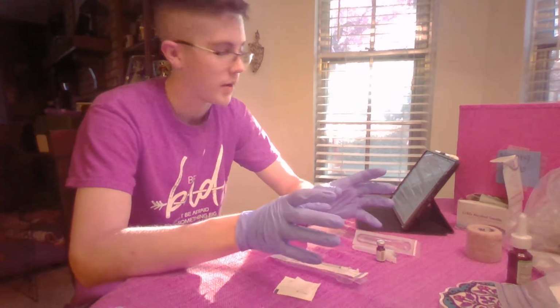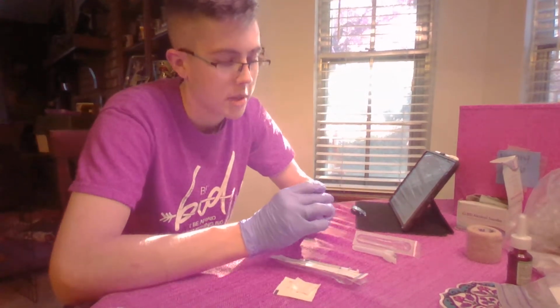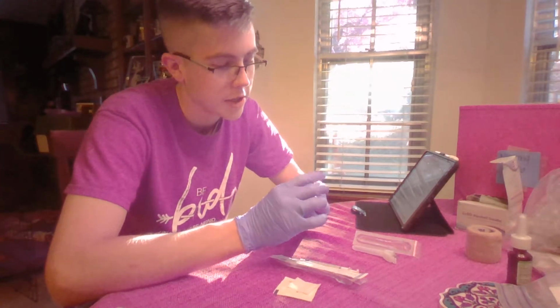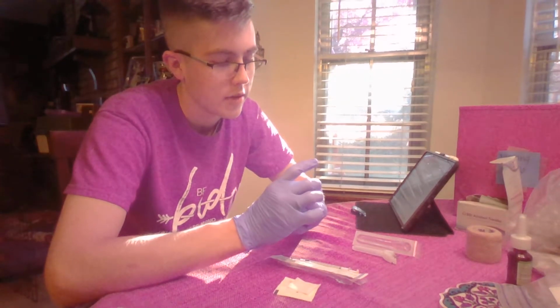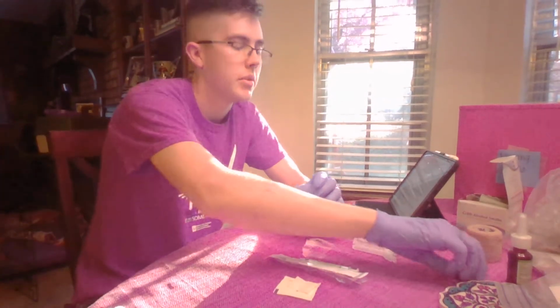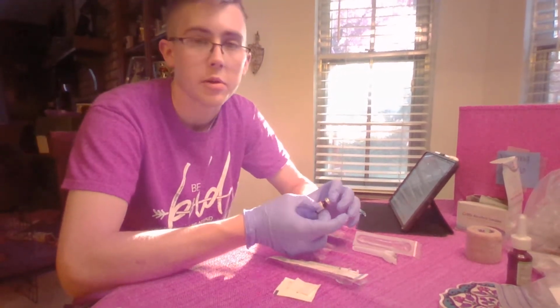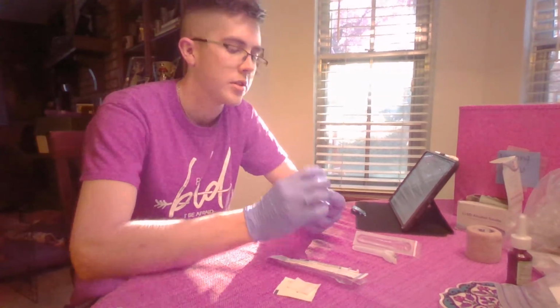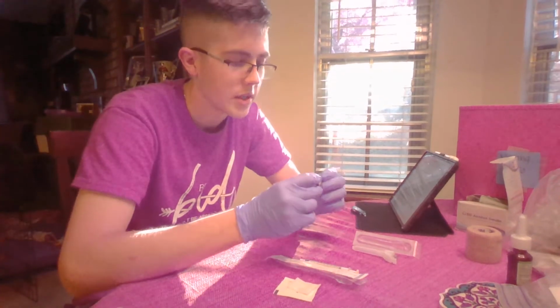So next, after I have gathered up all my materials, I will check my medication. I will look over it, make sure it's the correct medication, make sure it's the right dosage. I have to check to make sure that it can be administered intranasally. I will also check with my patient, have them give me 2 patient identifiers. I will inspect it for clarity as well as the expiration date.